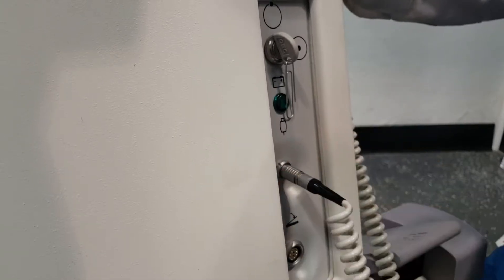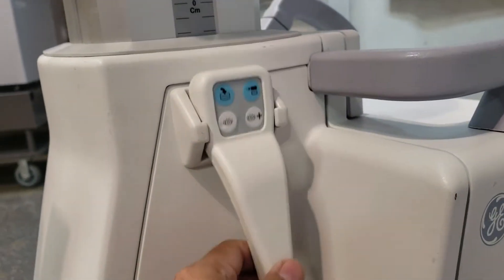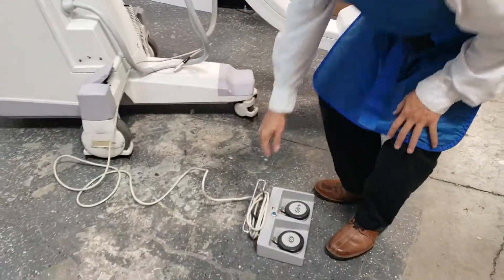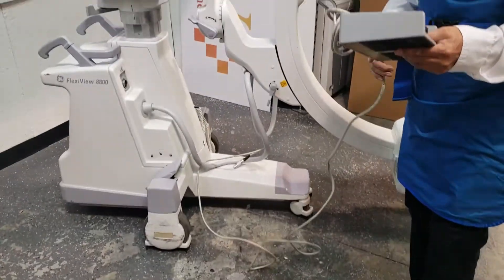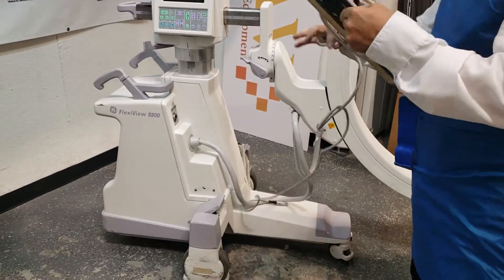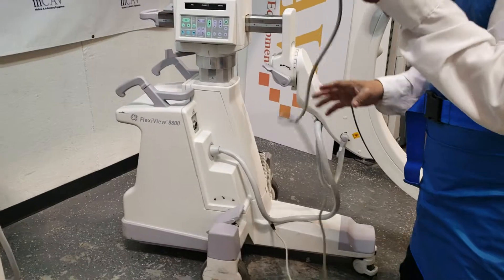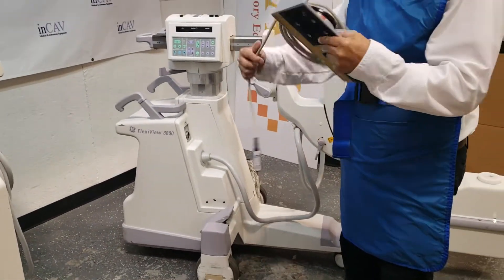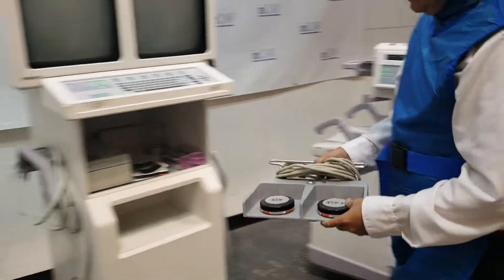Usually I leave the hand switch on, because here when you anchor the hand switch, you put the hand switch so you can tip it on.